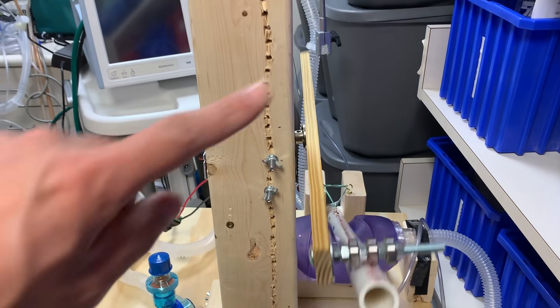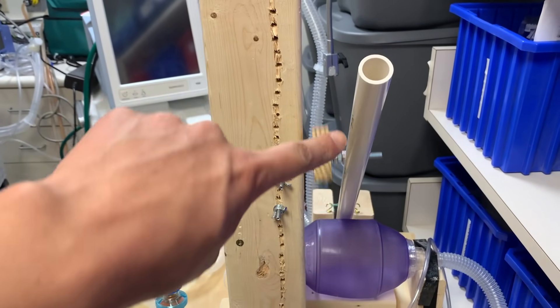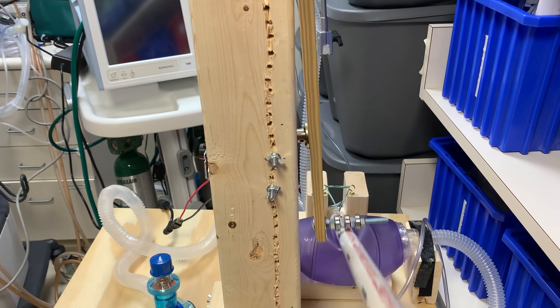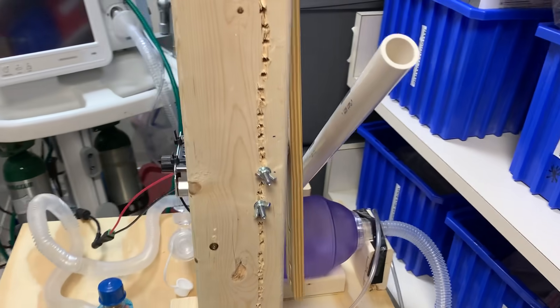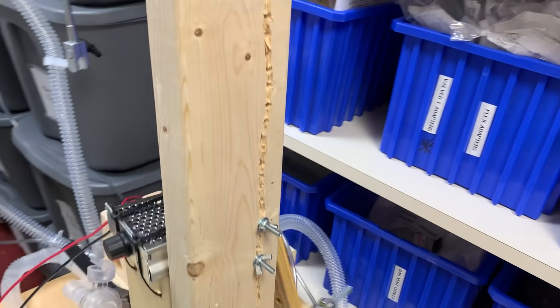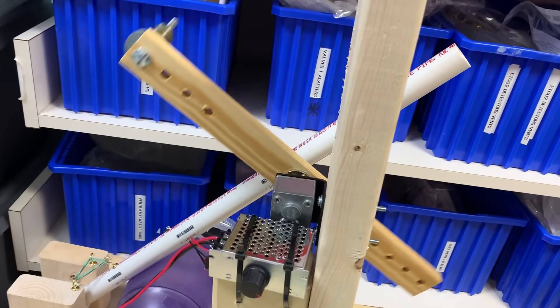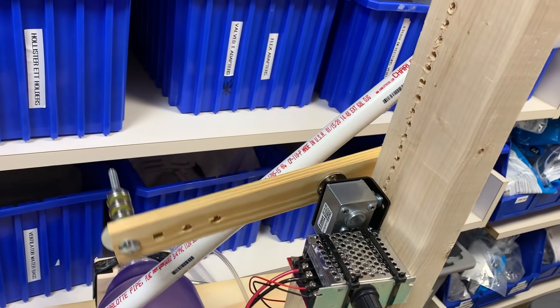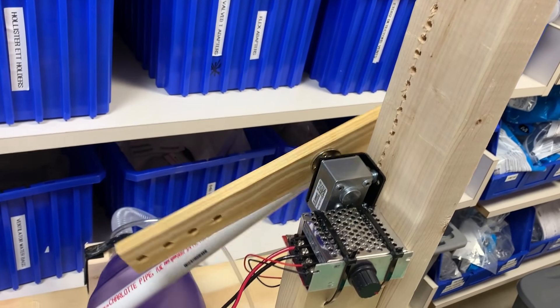We now have, on the rotating arm here, just one compression bolt instead of two. The two-bolt design was a little too torque-limited in order to give us the I to E ratios we wanted. So I switched over to a single-bolt design. That seems to be working pretty well.